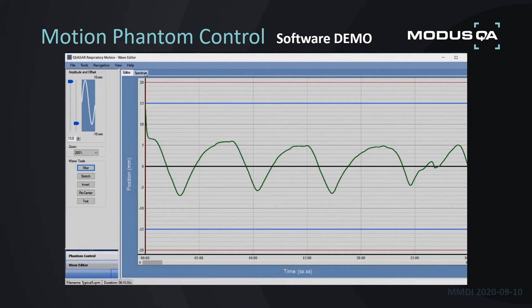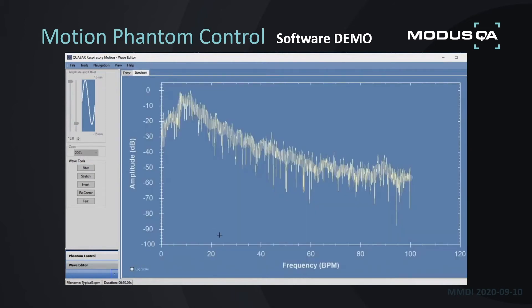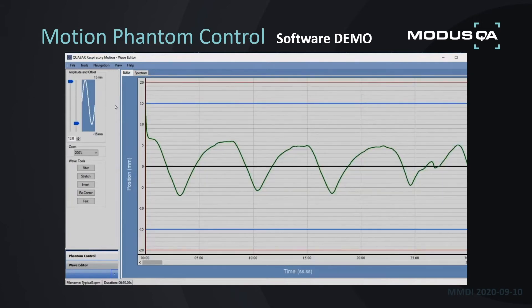We also provide a spectrum analyzer that changes the domain from time to frequency, so you can analyze your waveform to see which frequencies are contributing to your pattern. There are also simple cut, copy, and paste functions. When you bring in an imported waveform, you often get artifacts or unwanted motion — things like coughs or movement — that are undesirable.